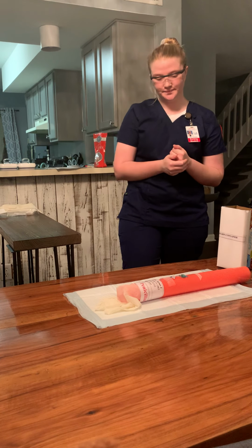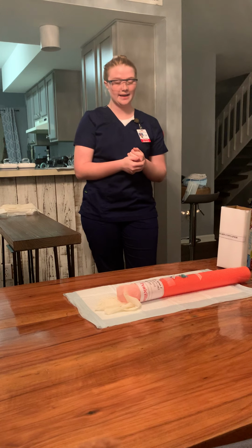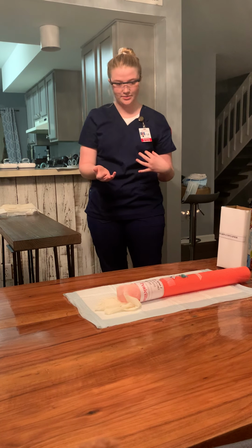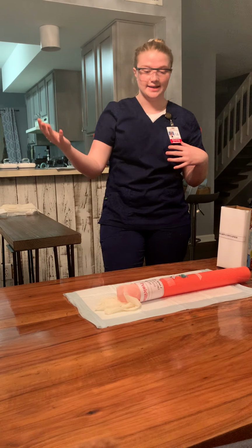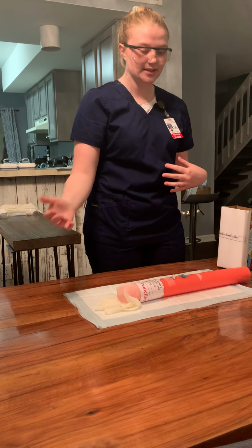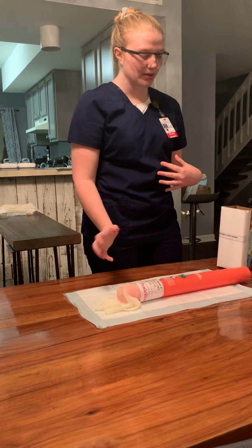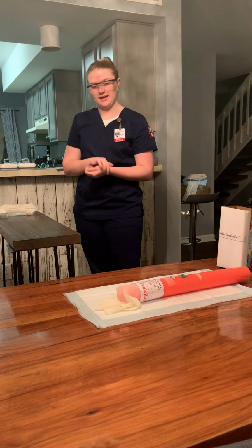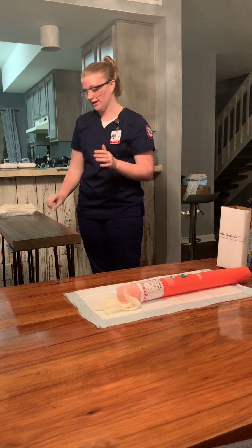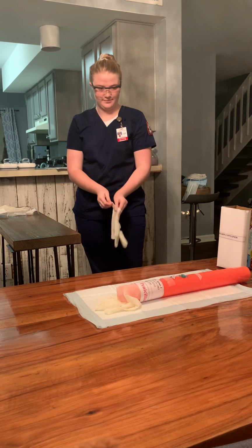And so now I'm going to show you how to discontinue the IV. And so I would start by placing the absorbent towel underneath the arm, which I have here. I'd perform hand hygiene, and I'd apply clean gloves.